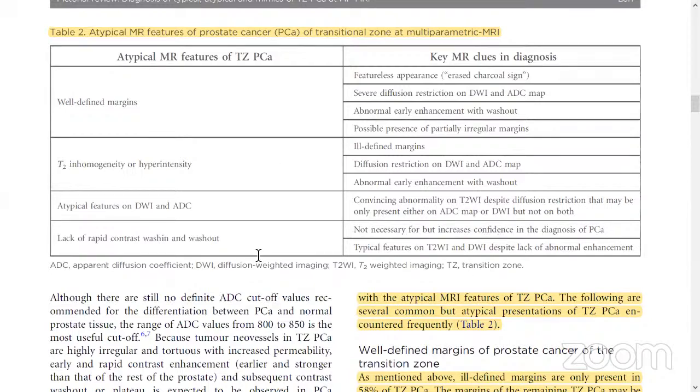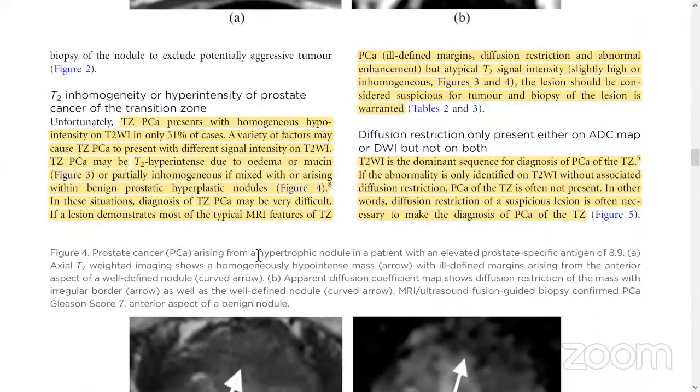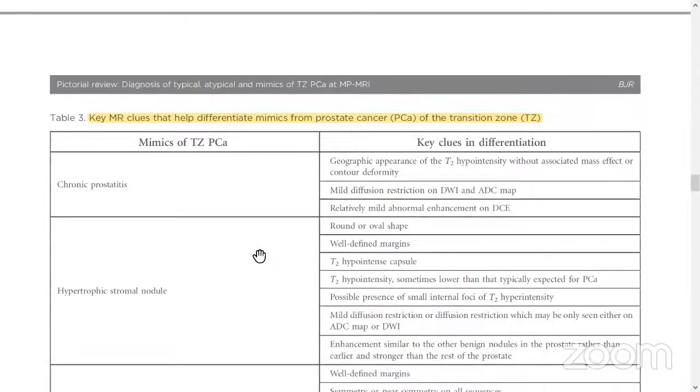So when you feel that it is fitting into tumor or PIRADS 4 as per T2 and diffusion, still it is not enhancing, it is okay. You don't need to go for the enhancement part to confirm your diagnosis. So all these four things can happen.